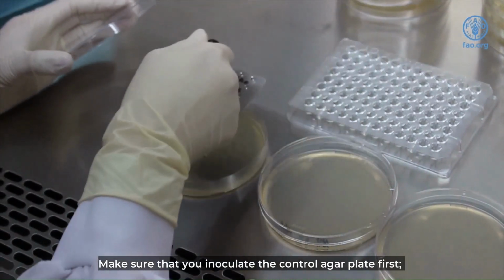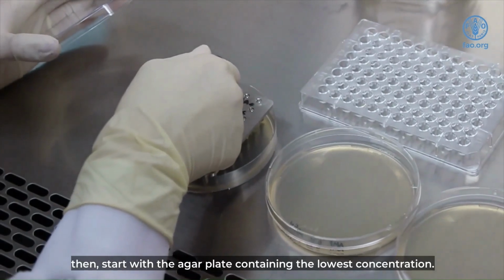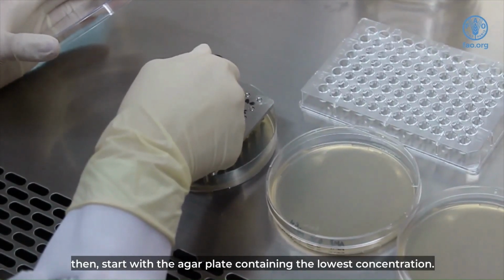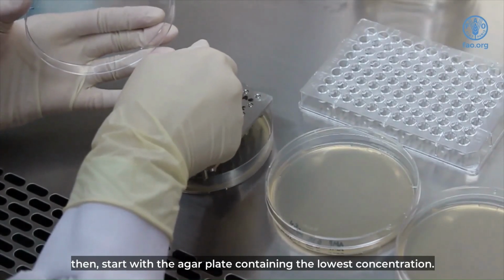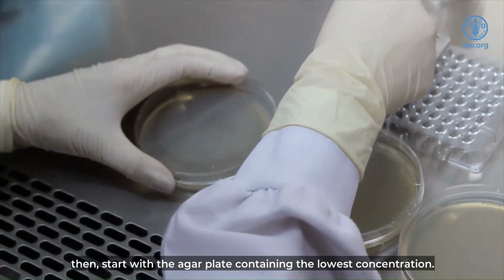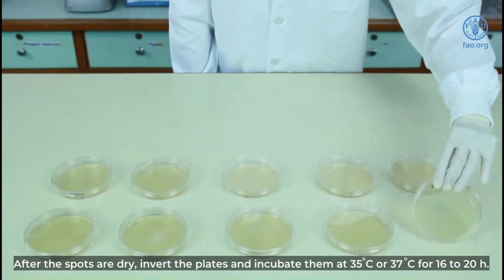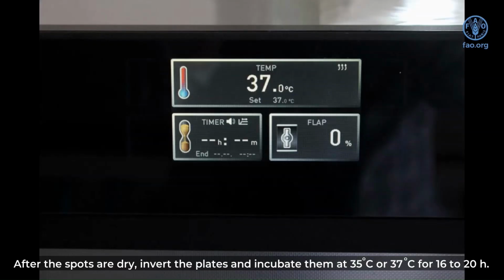Make sure that you inoculate the control agar first. Then start with the agar plate containing the lowest concentration. After the spots are dry, invert the plates and incubate them at 35 degrees Celsius or 37 degrees Celsius for 16 to 20 hours.